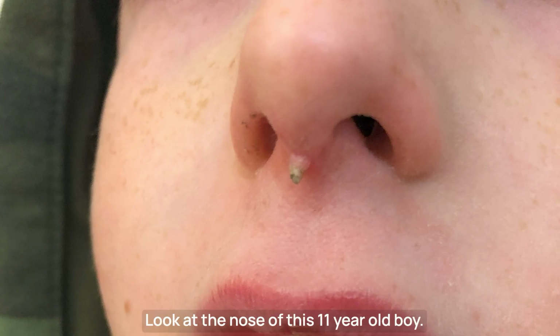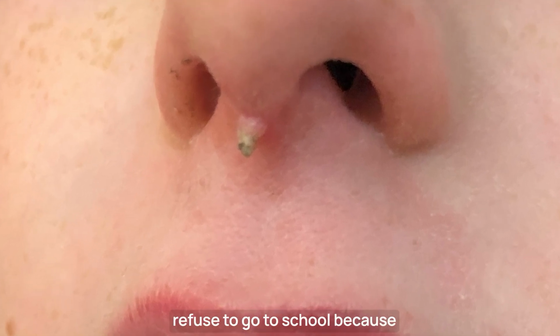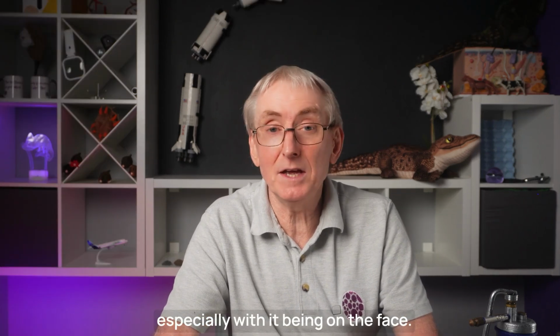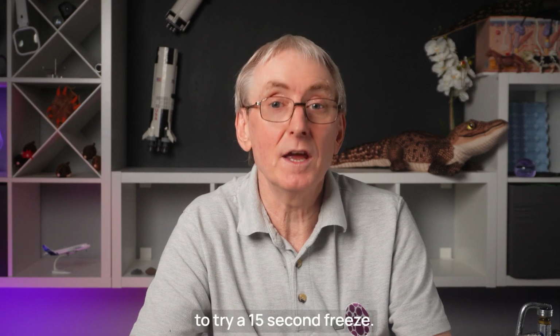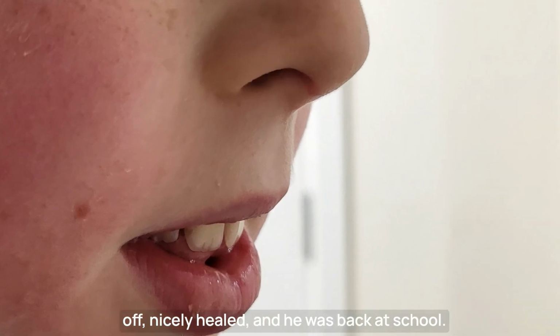Look at the nose of this 11-year-old boy. It's clearly a filiform wart. However, he was starting to refuse to go to school because people were calling him Rhino Boy. We discussed treatment with cryotherapy and the risk of scarring, especially with it being on the face. He and his mother were happy to try a 15-second freeze. Checking back a month later, it had dropped off, nicely healed, and he was back at school.